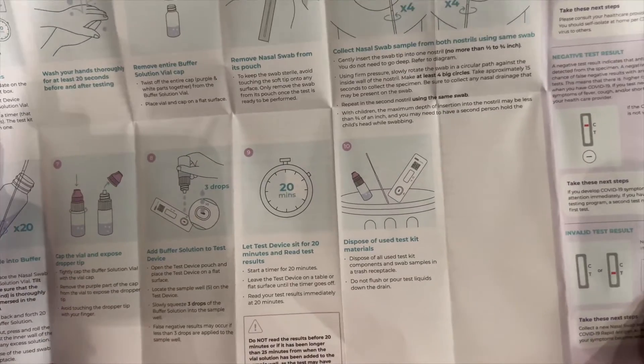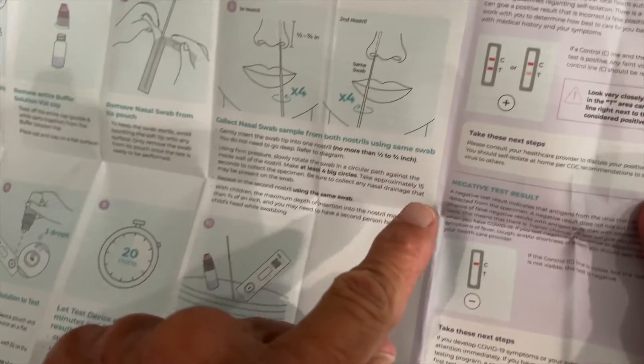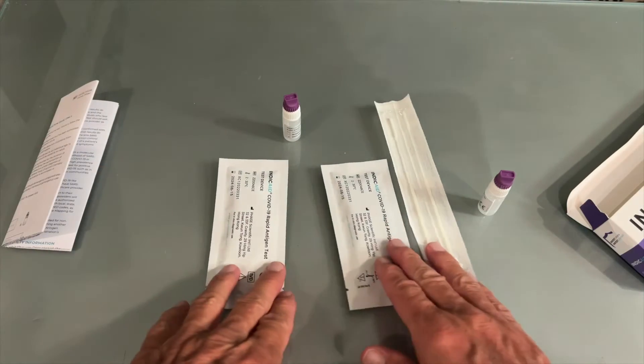You bring it over to your device, drop it in there, and within 20 minutes you look and see if you're positive or not. Two lines is positive, one line is negative — pretty simple, just like almost every single other one of these things I've done like 300 times since this nightmare started.